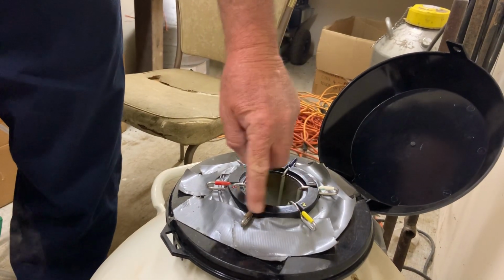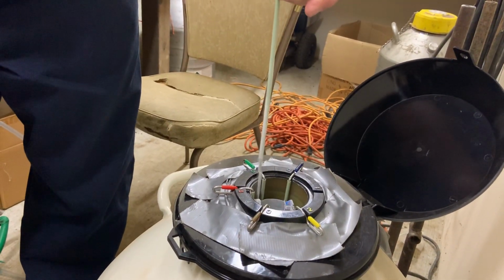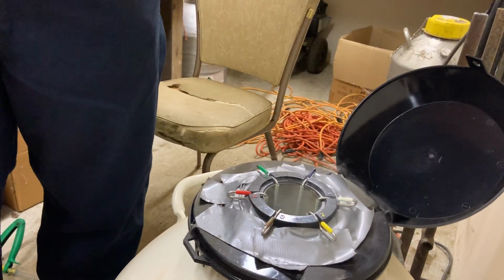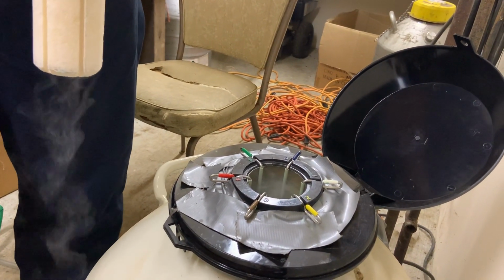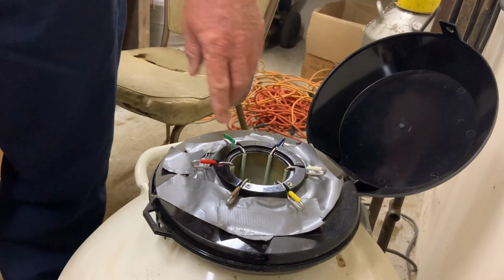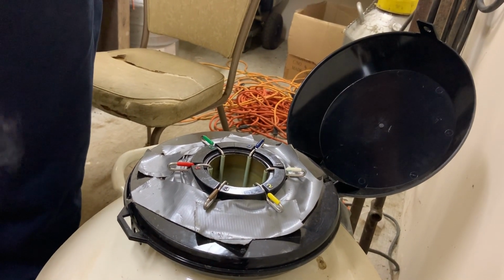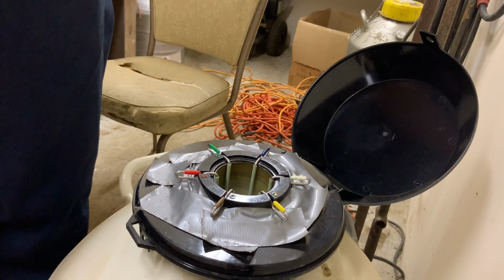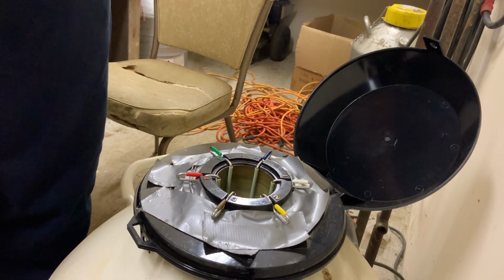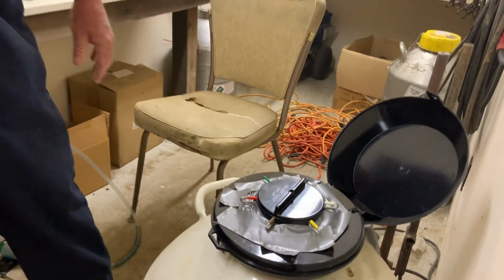There are 6 different holders here that contain a variety of semen. The straws of semen are actually down in each of those canes. The canes are kept in the cane holder, and whoever's tanked it would keep a list of which semen is in which cane in which cane holder, and that way you can go in and pull out just exactly what you need. So you have to keep it pretty well organized. We try to keep that lid in there when we're not doing anything.